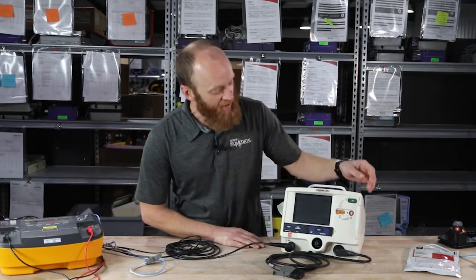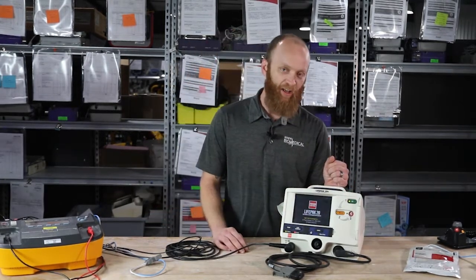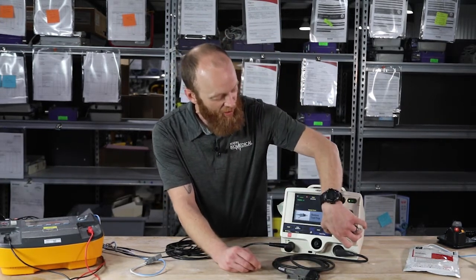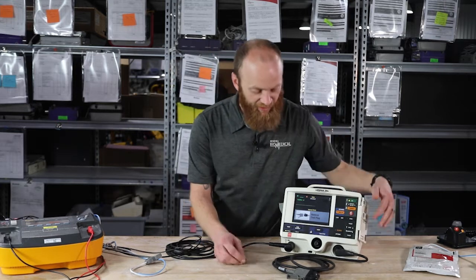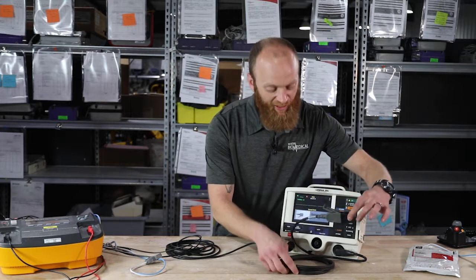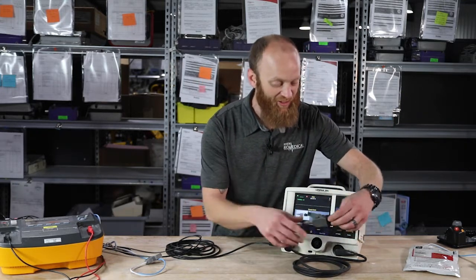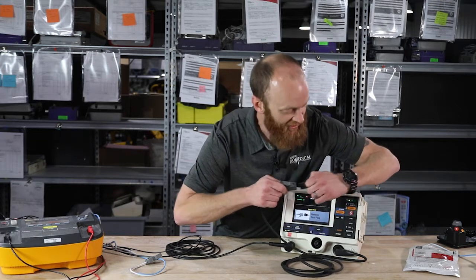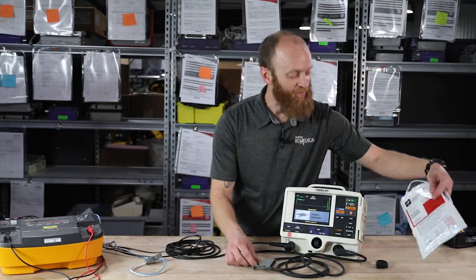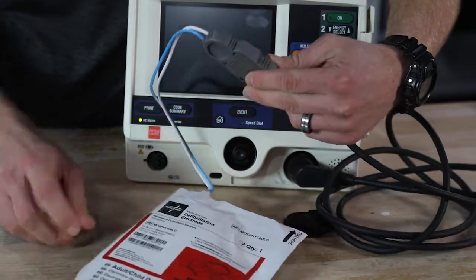We're going to power it on and go over the pads and paddles. Taking it out of AED mode by hitting the manual button. Once again it's assuming you're saving a life — if you have the test plug in, it will at 3 a.m. run a user test, wake itself up and do your daily test. I'm going to unplug the user test and install the basic adult and pediatric pads or electrodes.